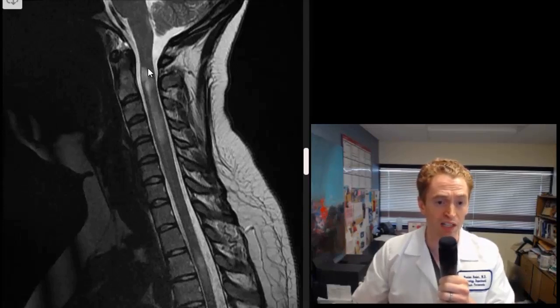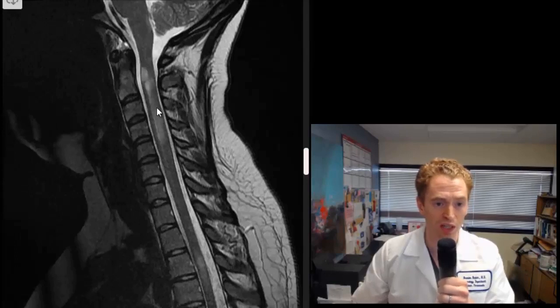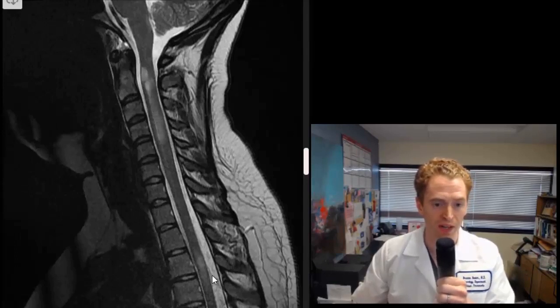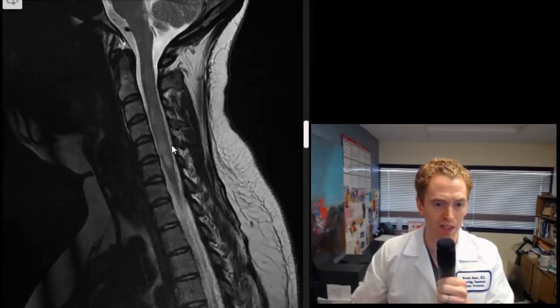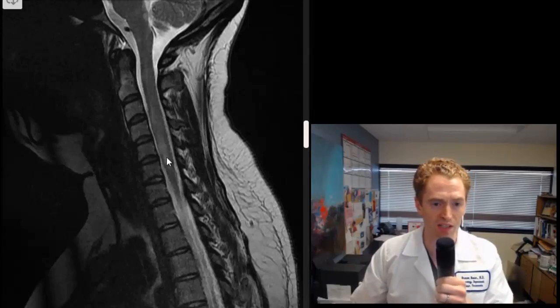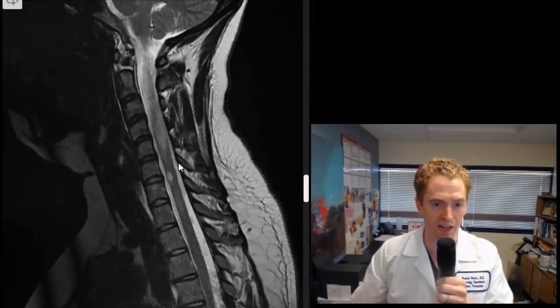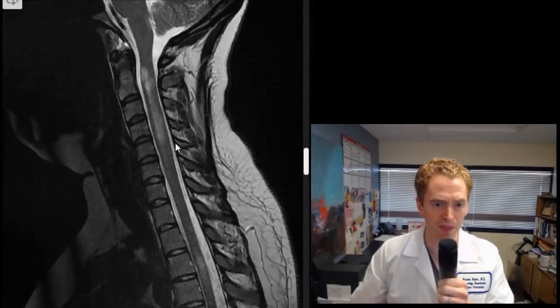Directing attention to the multiple sclerosis lesions, you can see there's one at C2, another patchy lesion at C4, and another one down at about T3. Scrolling a little bit, you can see another lesion in the C5–C6 area and then down at C6–C7.